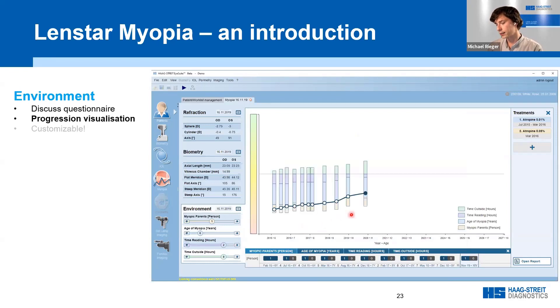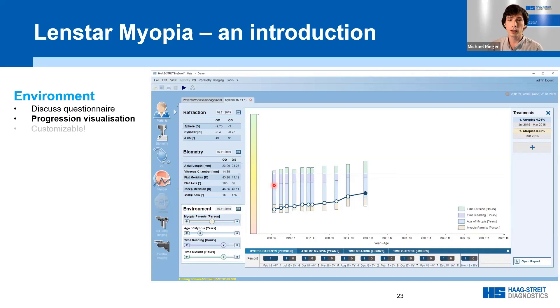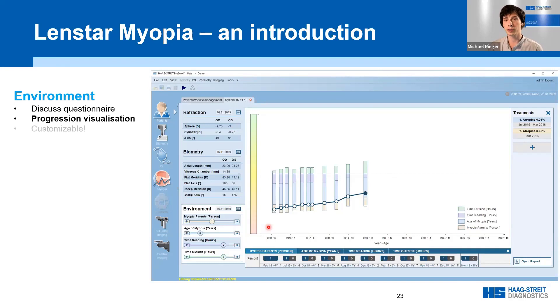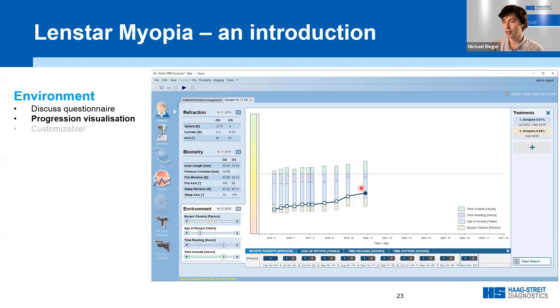This is visualized in the software, showing fixed factors like myopic parents and age of myopia onset alongside factors that parents can influence — specifically, near work time and time spent outside. There is currently no quantitative measure correlating diopter values or axial length change with, for example, time spent outside, so only a qualitative measure is provided. The graph shows how parental involvement in managing near work and outdoor time can positively impact myopia progression.